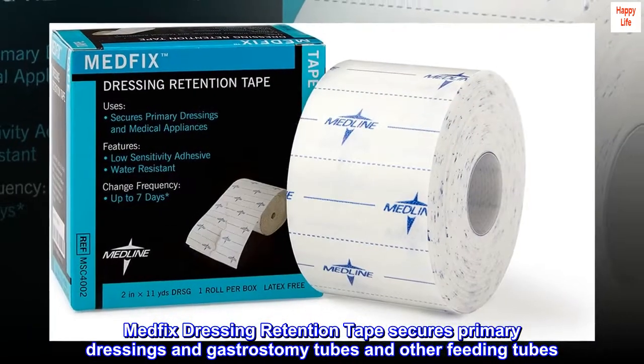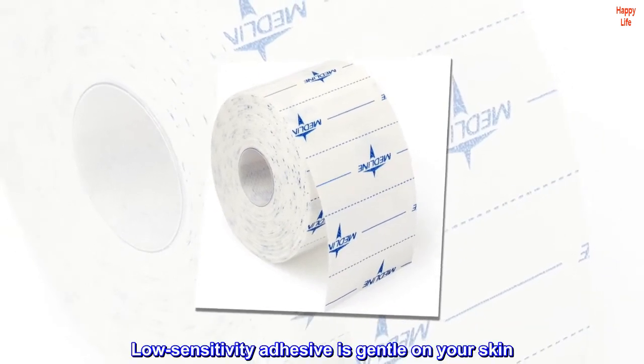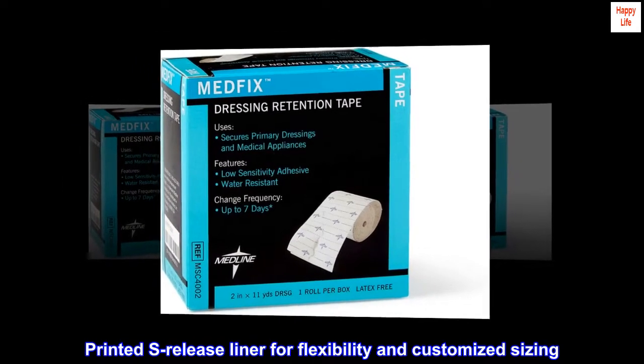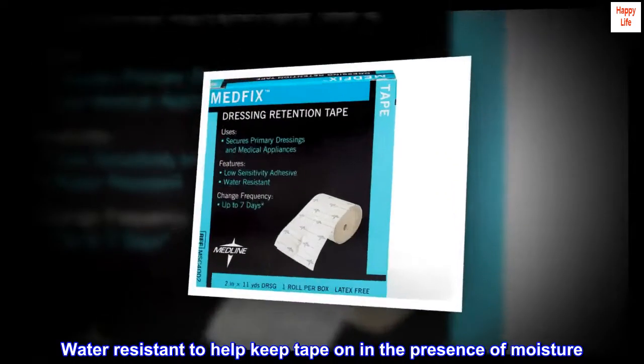Medfix Dressing Retention Tape secures primary dressings and gastrostomy tubes and other feeding tubes. Low-sensitivity adhesive is gentle on your skin. Printed S-release liner for flexibility and customized sizing. Water-resistant to help keep tape on in the presence of moisture.